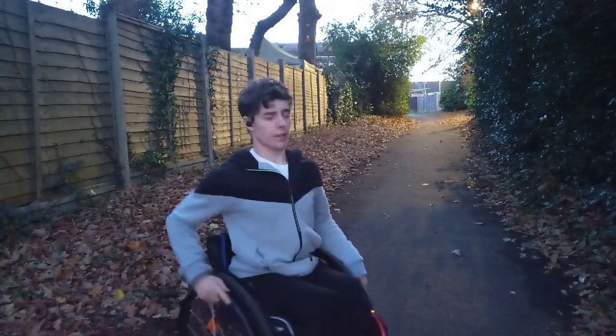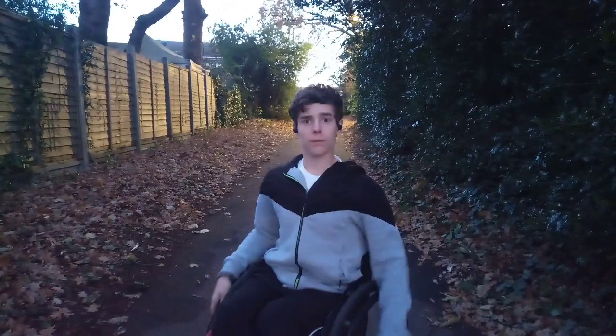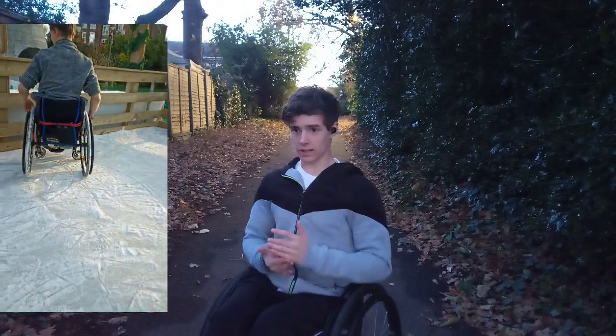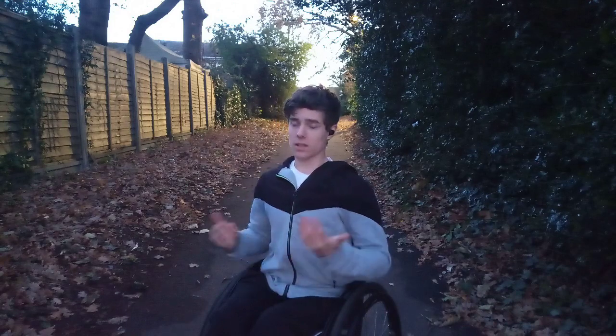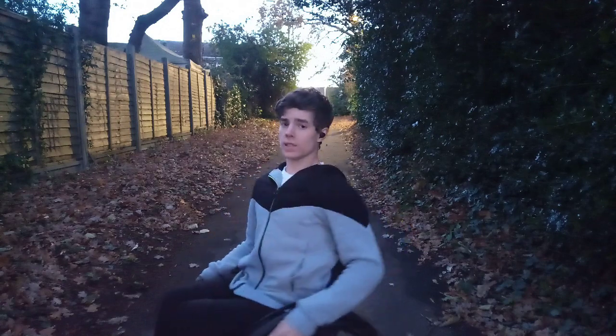So first things first, what are some issues that can happen in colder weather? The first one is if the ground is frozen or if there's any ice on the road. Now, I did a video ice skating and that honestly made it look fun, and it was fun, a good time, but there are some issues that are similar to driving in cars. Obviously not quite the same, but very similar. The first thing is that it's a bit difficult to push around, and you do need to change your pushing style a little bit.